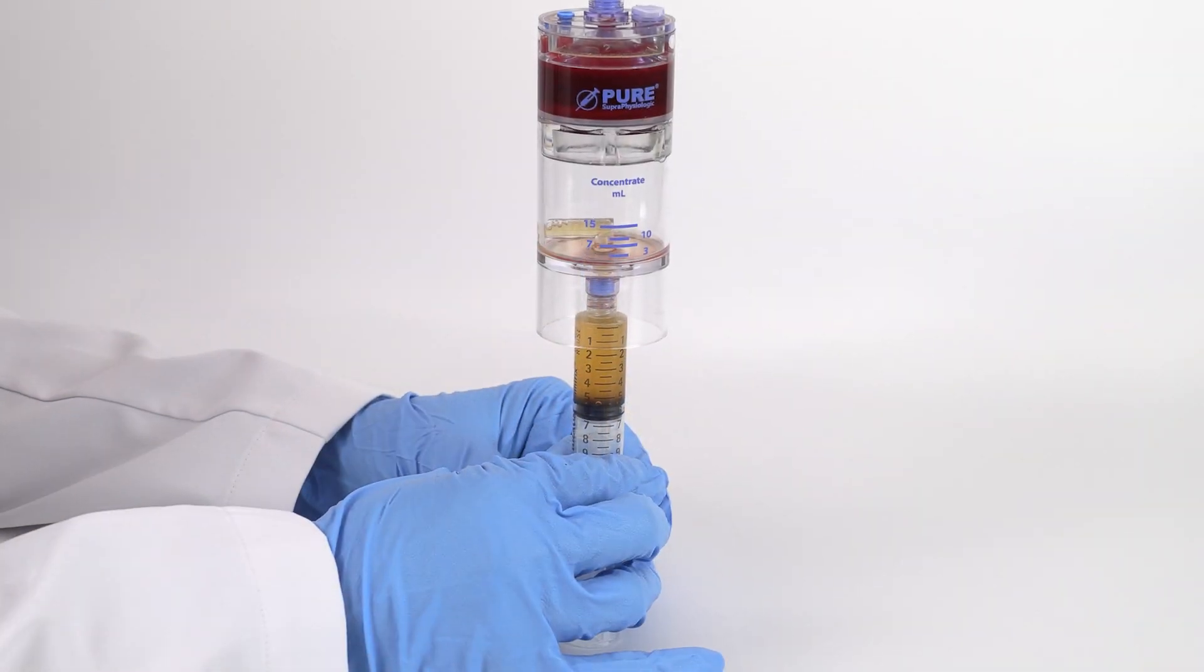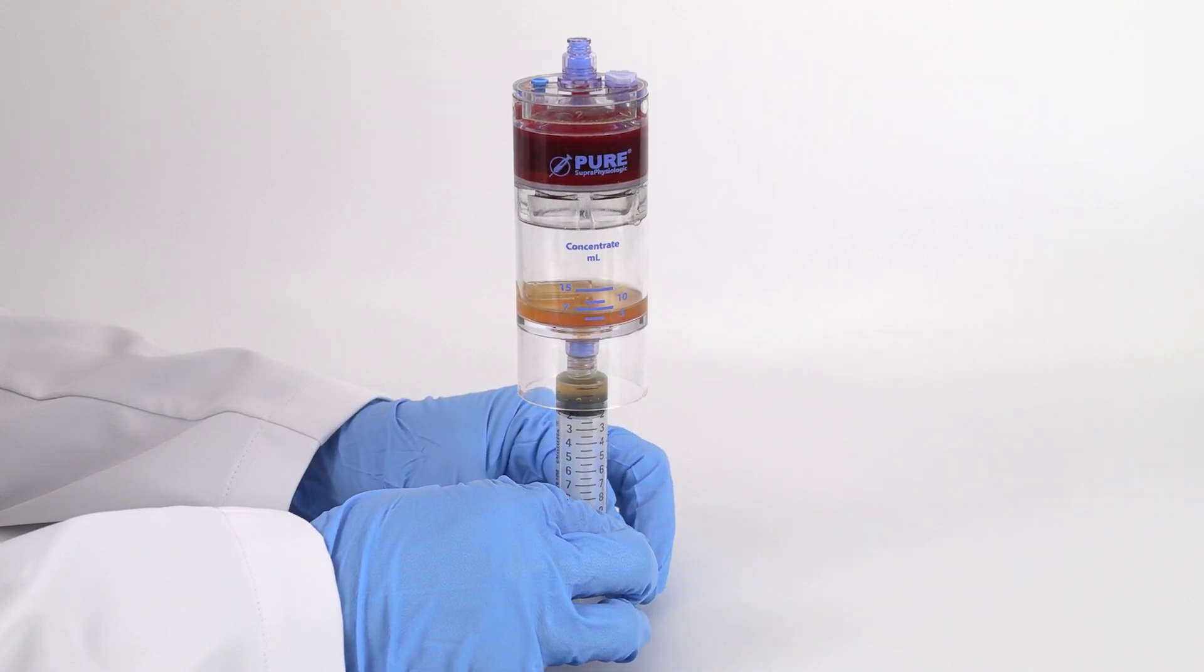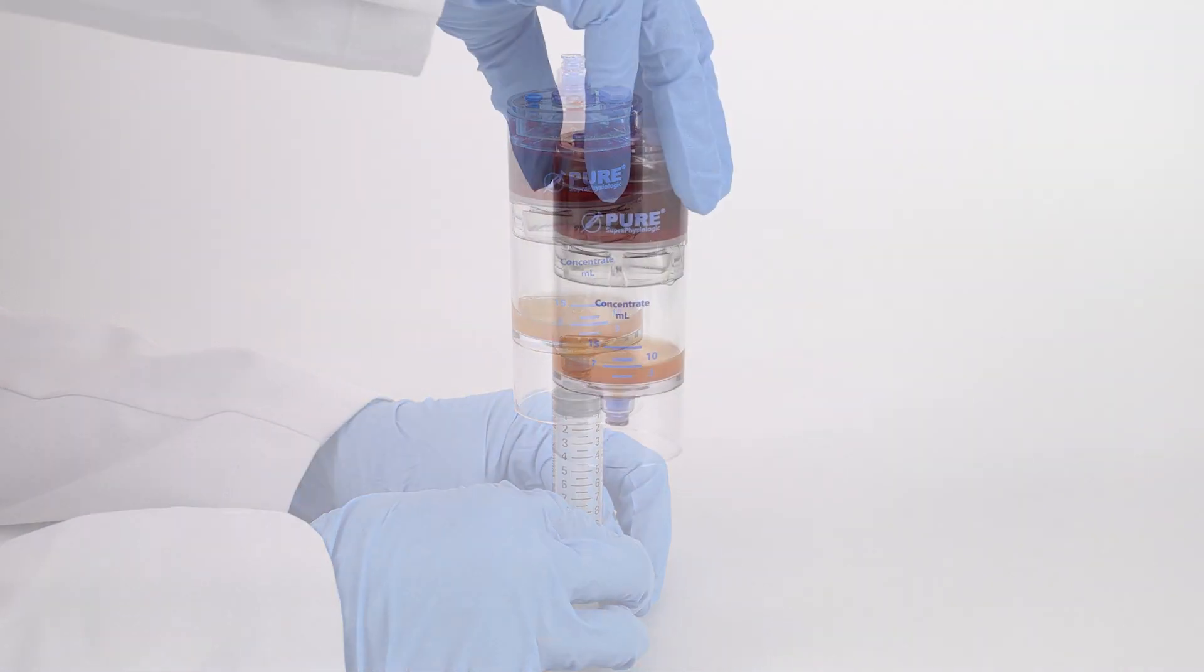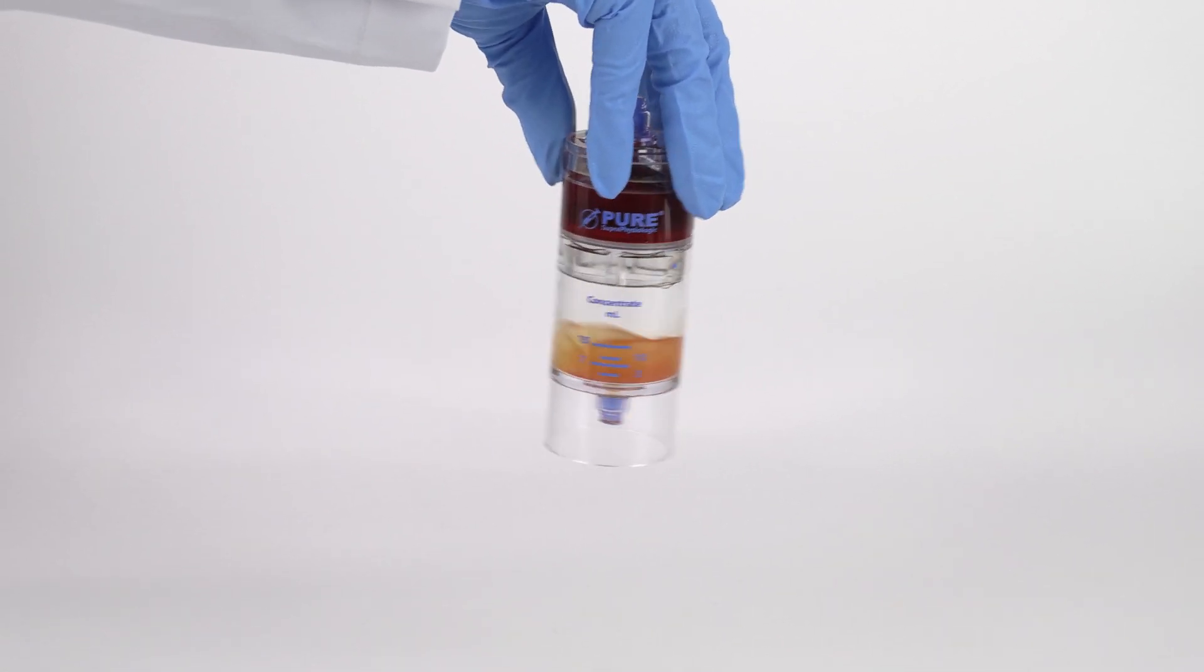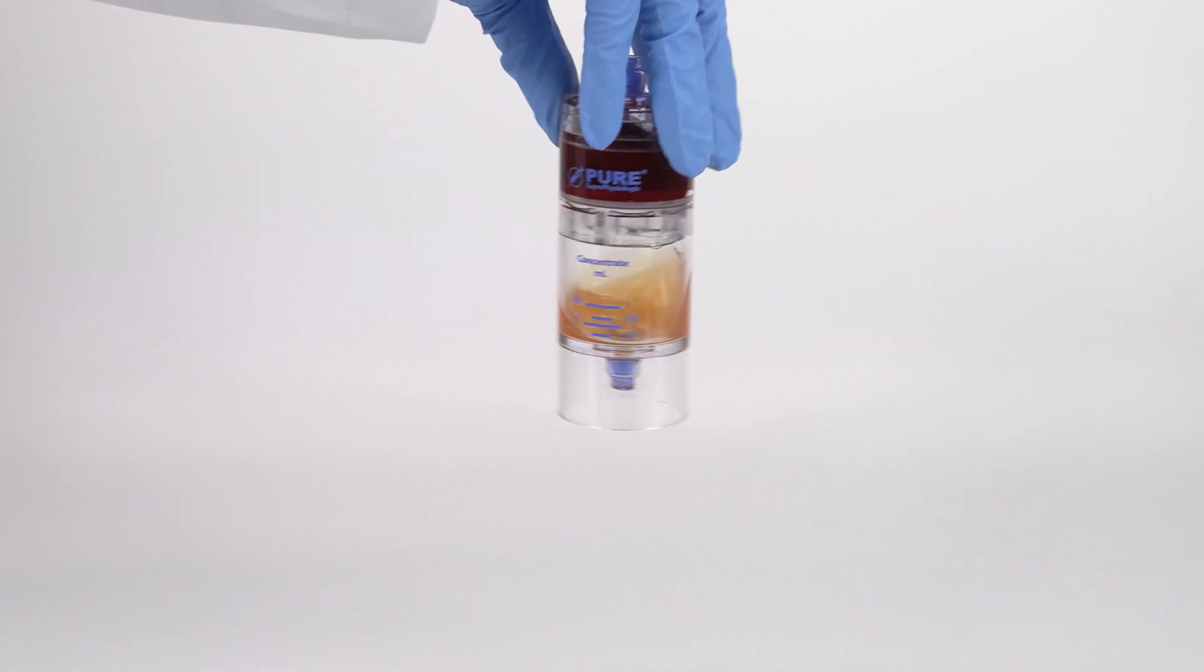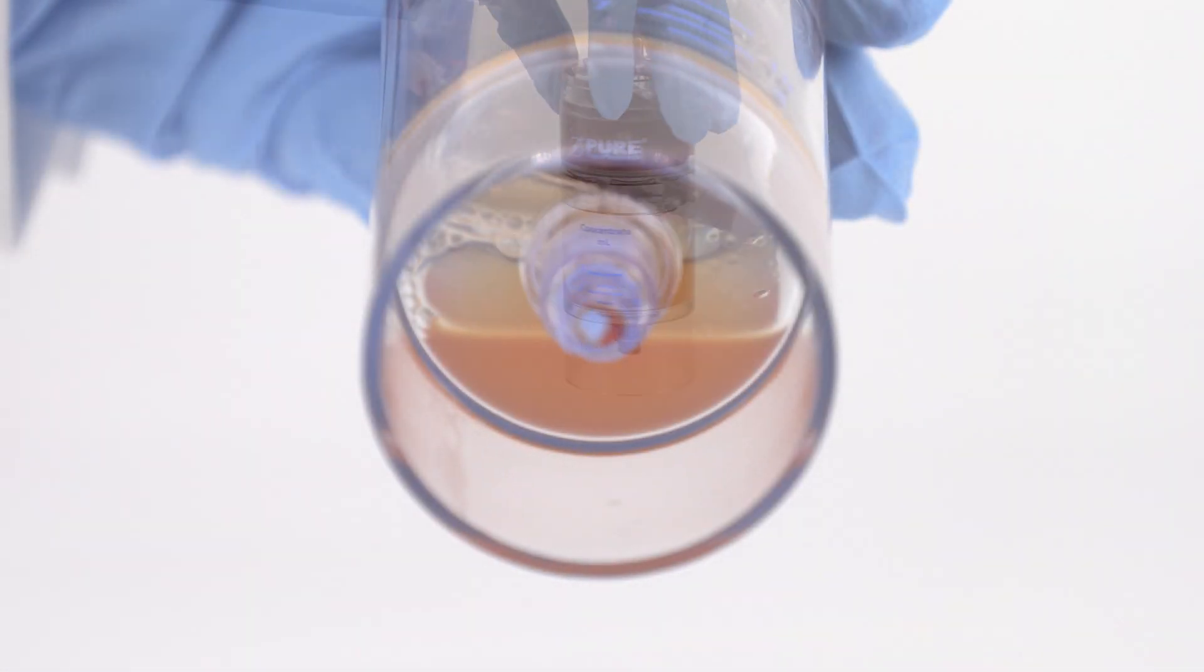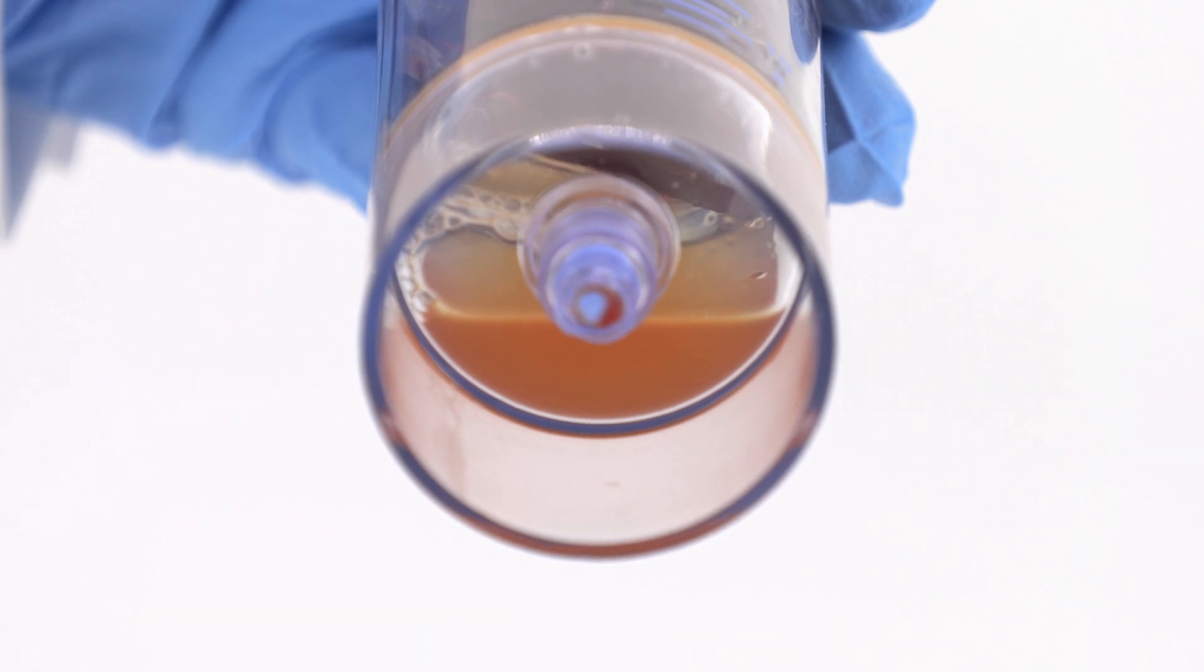Inject the protein-rich plasma into the bottom port of the concentrating device containing the platelet buffy coat. Re-suspend the platelet buffy coat into the protein-rich plasma solution by swirling it back and forth. Do this until the buffy coat is fully re-suspended and is no longer visible at the bottom of the device.